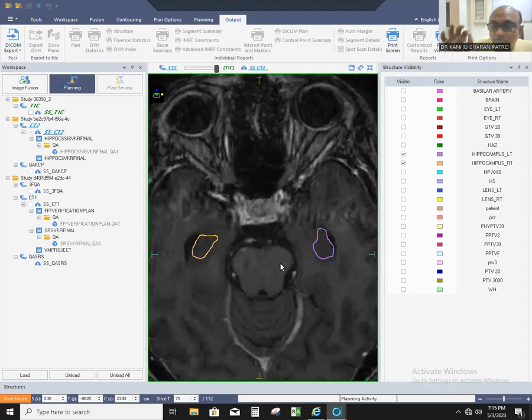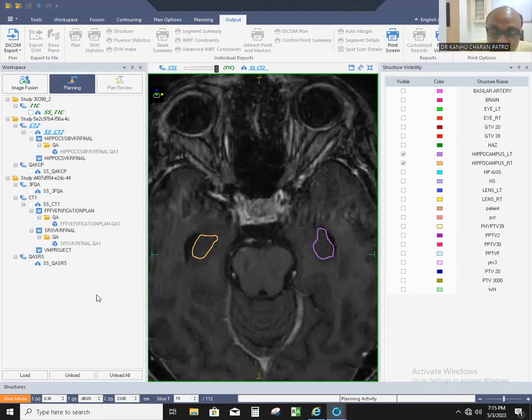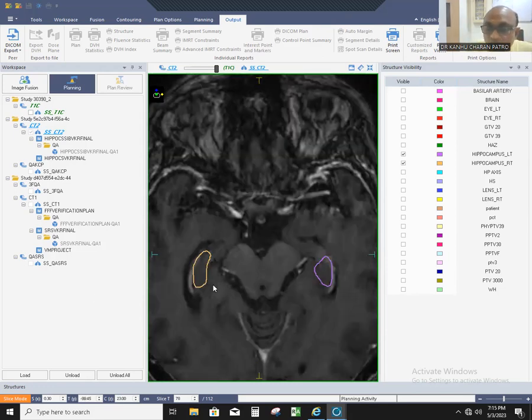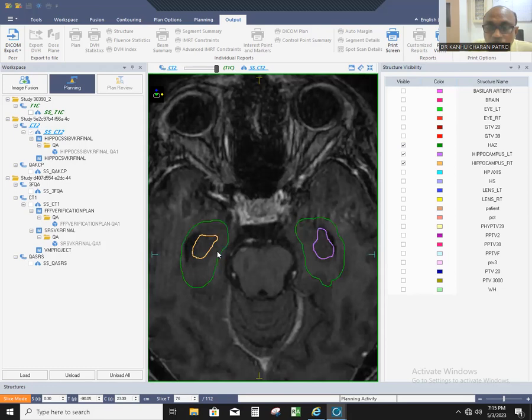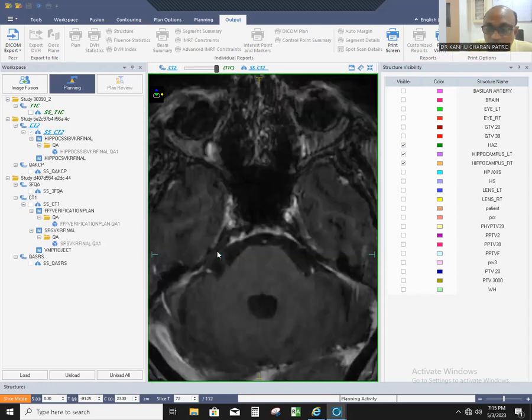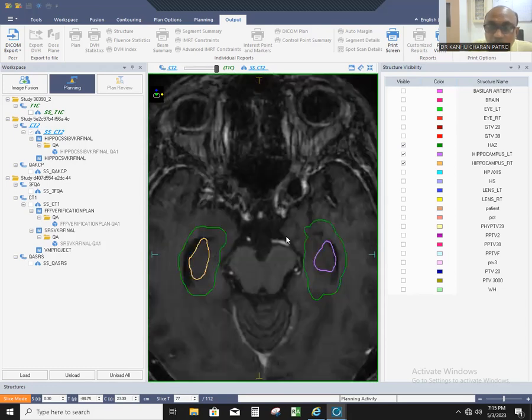This is called hippocampus contouring. The hypointense, posteromedial part, from the temporal horn to the quadrigeminal cistern superiorly, is sufficient for the contour. You have to give 0.5 centimeter around this area — this is called the hippocampus avoidance zone.